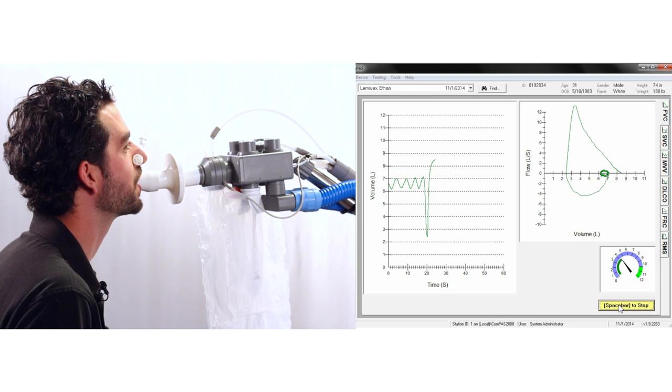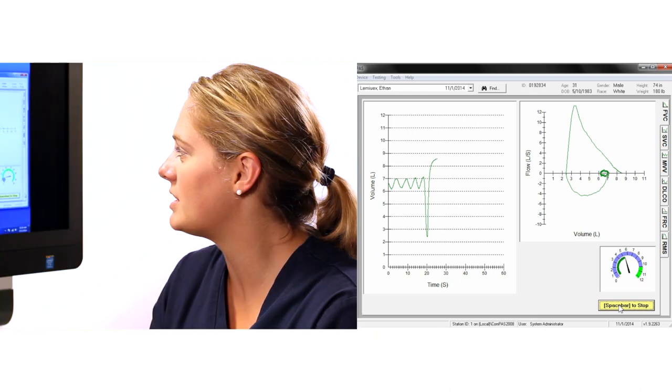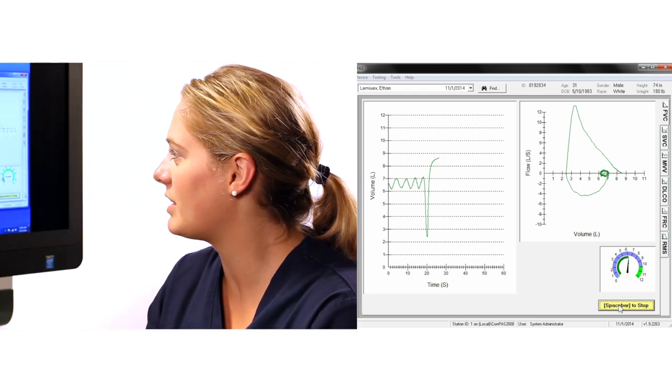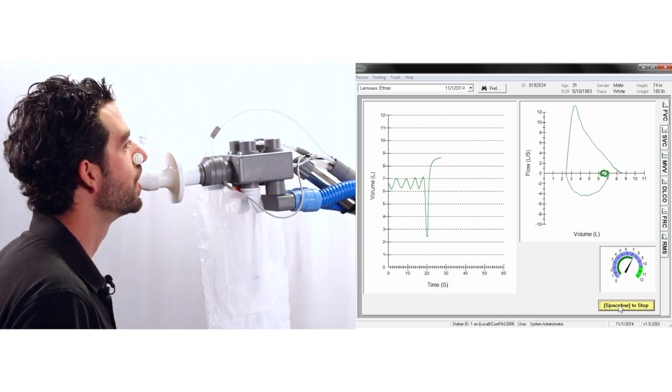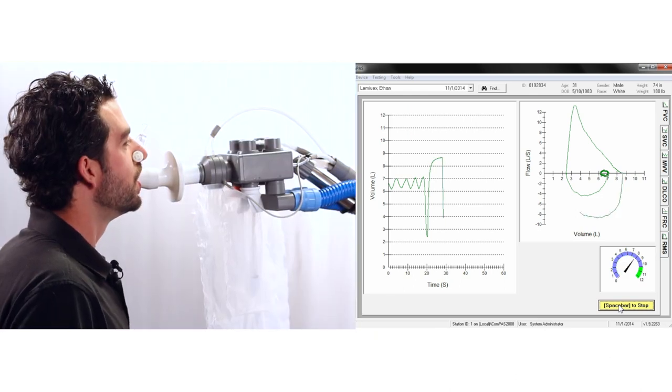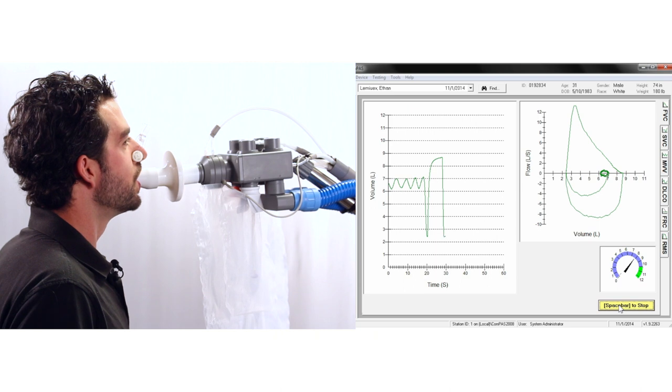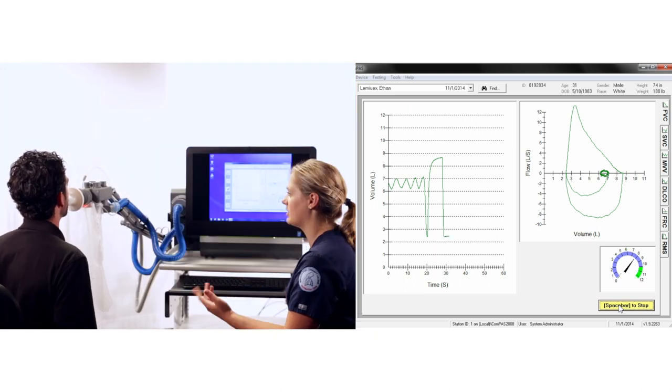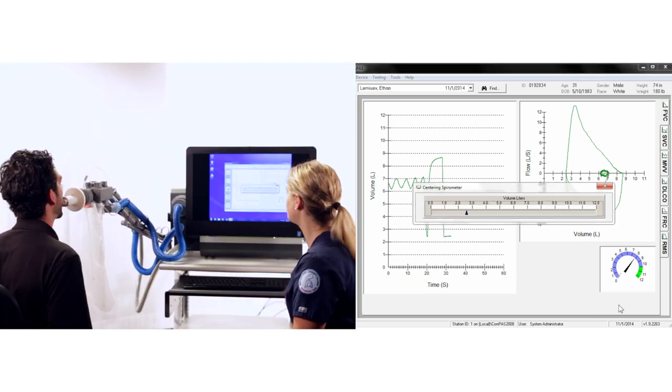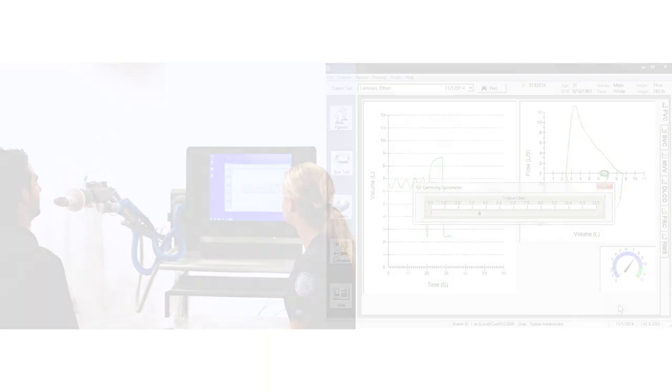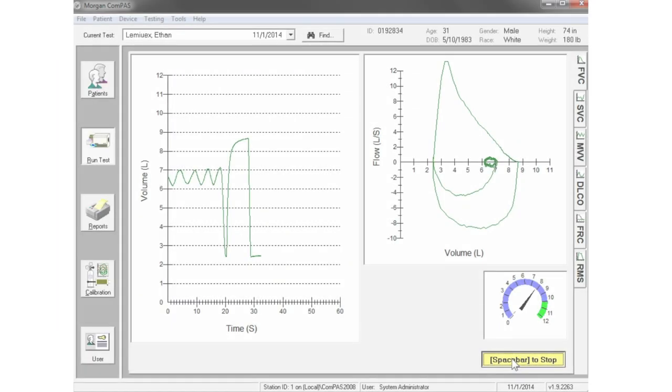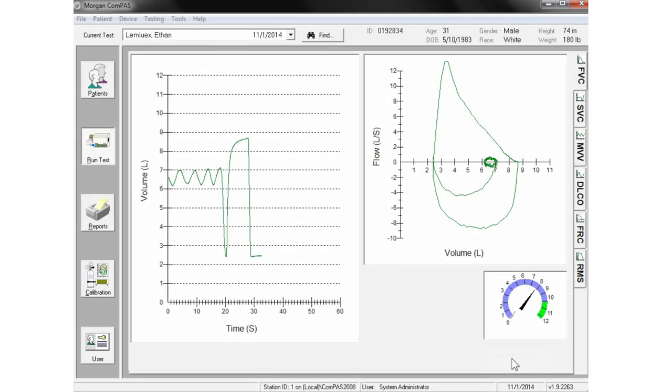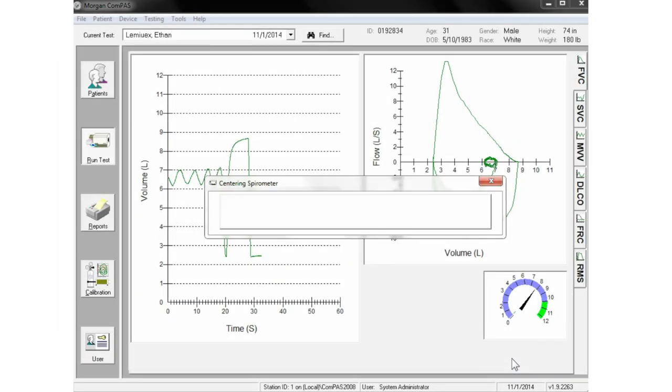When the patient is completely empty, instruct them to breathe in until completely full. These instructions must be emphatic to ensure maximum effort.